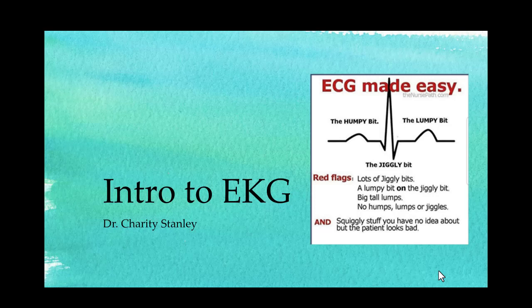So, EKG is something that many nurses really don't get, and they think it's a bunch of just squiggles on a page that doesn't make much sense to them. But it's very important that you know what these different squiggles mean because they actually have important stuff.